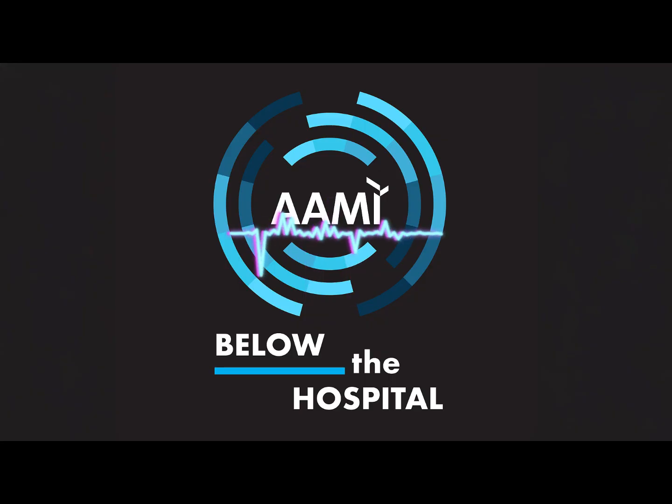Well, first and foremost, voluntary consensus standards and other technical guidance will not supplant law or regulation. So you're always going to defer to the regulations that exist. And AAMI is very careful with that; we'll point to the relevant regulations in some of the standards. So, for example, in ST79, which is Comprehensive Guide to Steam Sterilization and Sterility Assurance, we're going to refer to some of the OSHA standards, some of the Department of Transportation regulations as well. So we don't intend for these to supersede or go above the law. They're also intended to work in complement with instructions for use and facility policy. So I think that's an important bit of information about how standards interact with both regulations and manufacturers' instructions, what's coming with the device, and then what the facility would expect.